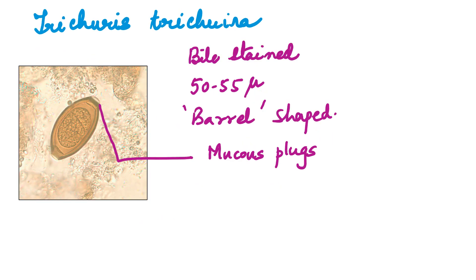Next is Trichuris trichiura. Now we've moved on to the large intestinal nematodes. The egg is very typical — it is barrel-shaped. In microbiology, remember two barrels: one is the barrel-shaped egg of Trichuris, and the other is the barrel-shaped arthrospores of Coccidioides immitis and Posadasi. So barrel-shaped eggs with an unsegmented ovum — the larva has not yet developed — and you can see the bipolar mucus plugs. 50 to 55 microns, barrel-shaped eggs with bipolar mucus plugs: very typical of Trichuris.